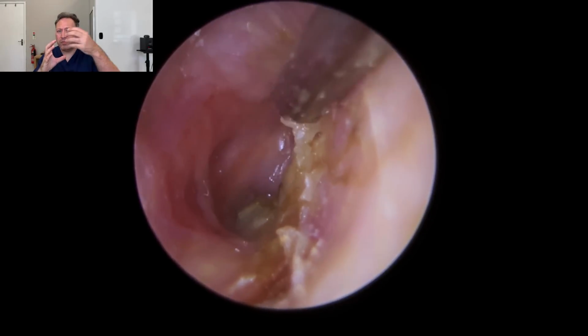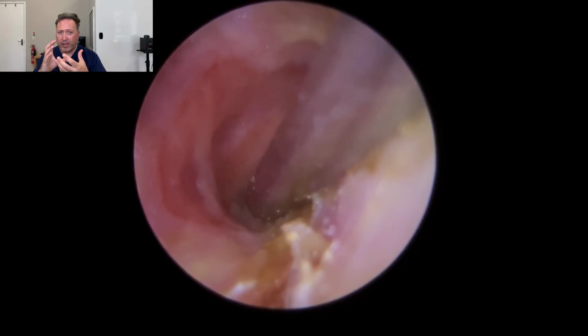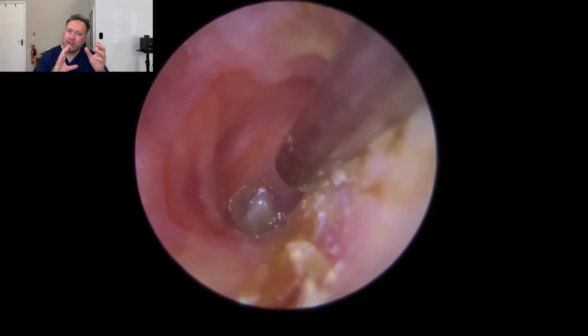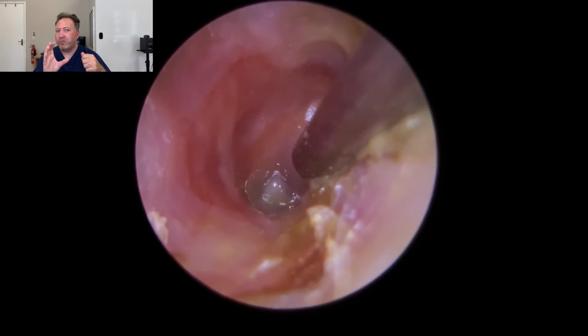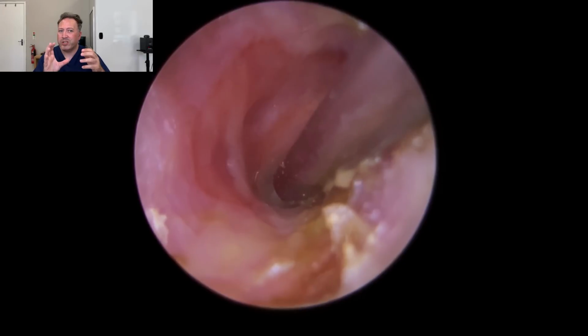So what's happening is that the fluid that we produce in the middle ear space is actually discharging through that hole in the eardrum, and it's been soaking the back of this wax, which has caused this really kind of slushy consistency there. So with this patient, it's unclear whether by using the Q-tip they've actually reperforated the eardrum, or whether this is just something that opened up again that no one's really spotted before.